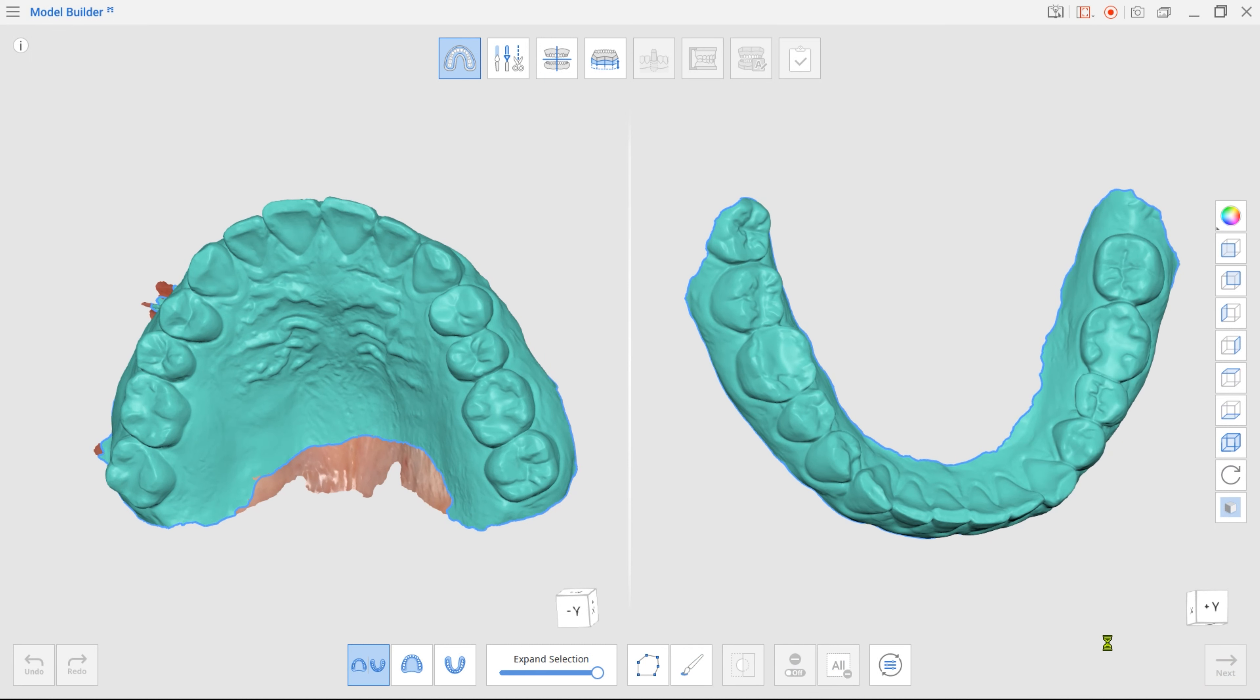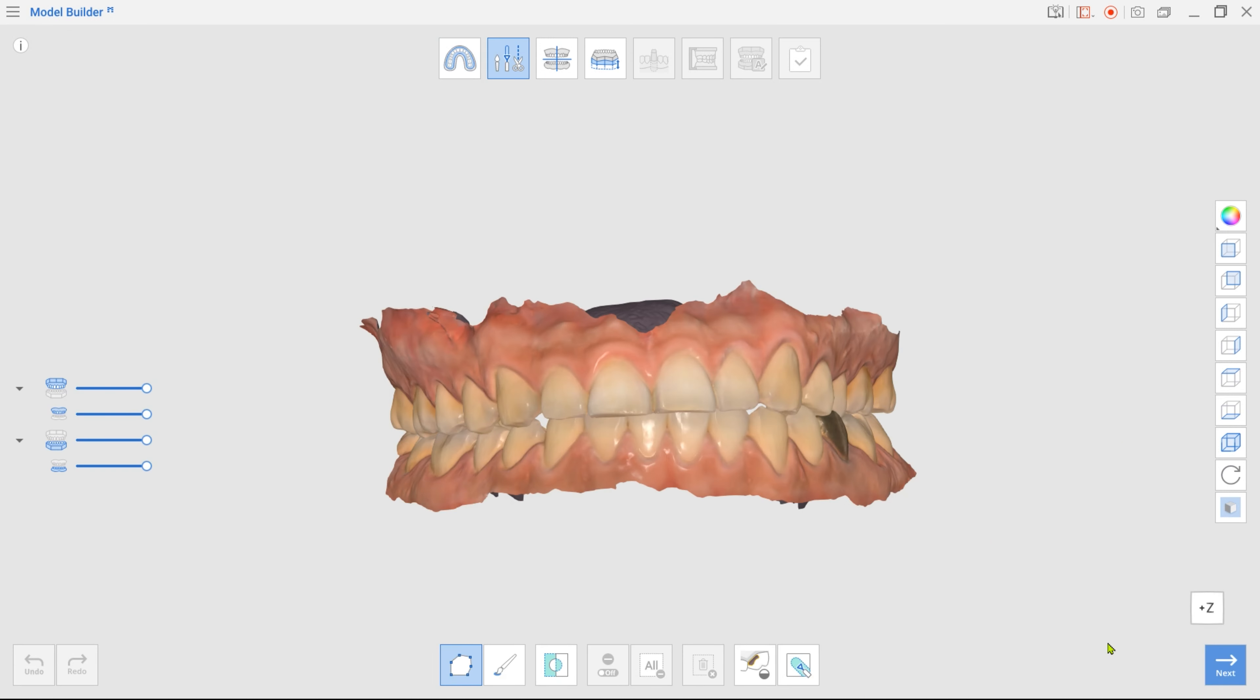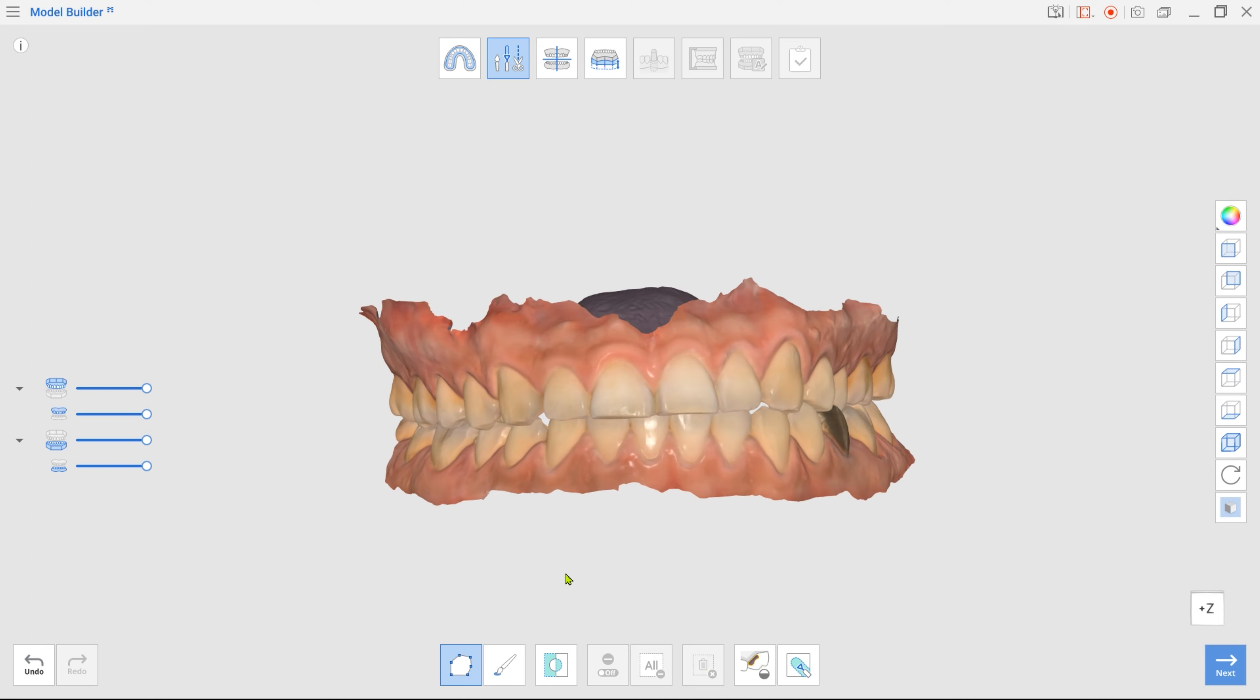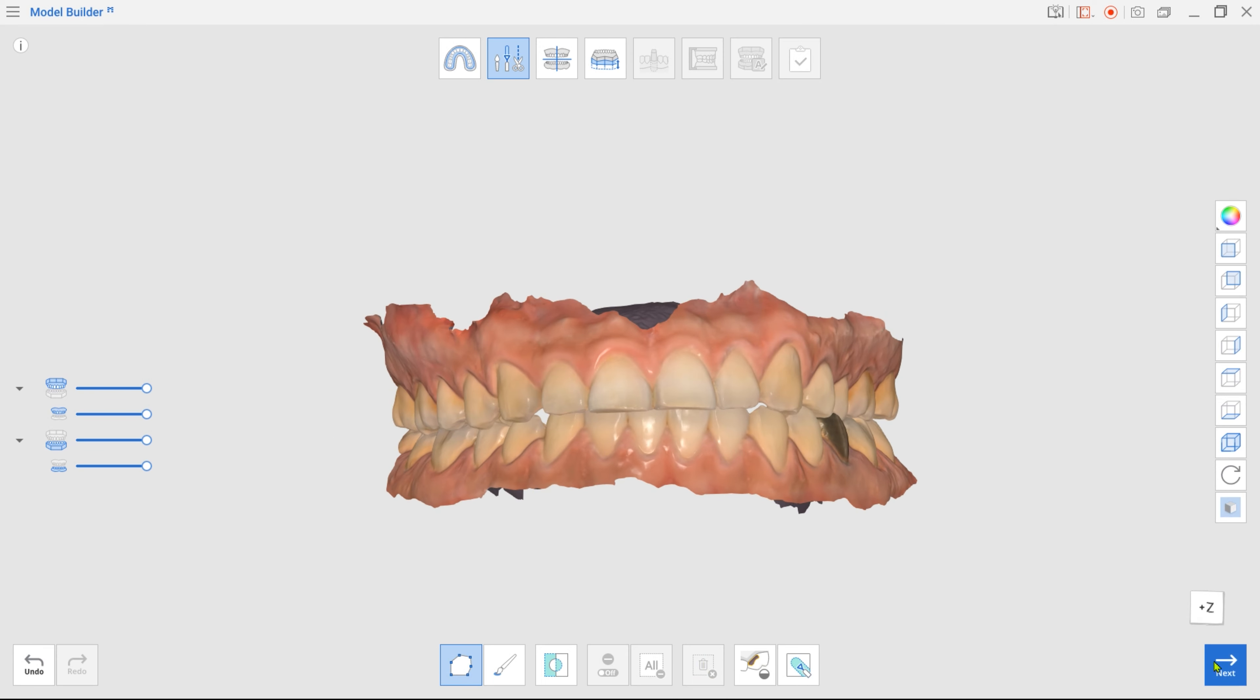Click Next to enter Edit mode, where you can trim the scan data or fill in holes. Once done, move to Alignment mode.